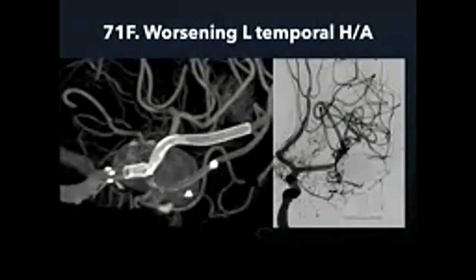That's the construct on the Dyna CT, or after the stent deployment. On the right, you can see the final coiling result. That little loculus down the bottom is part of the same aneurysm. Coils just wouldn't go into it, but I suspect that will go away with the flow diverter. But she's only about 6 weeks out now, so I haven't got a follow-up yet.